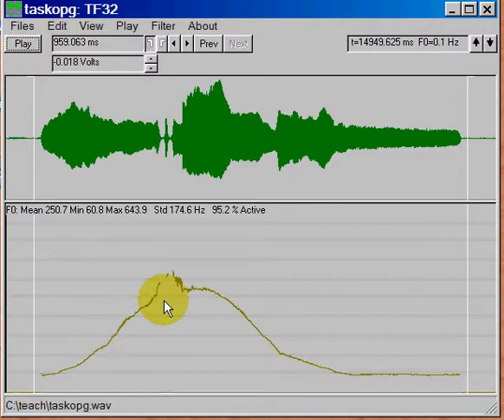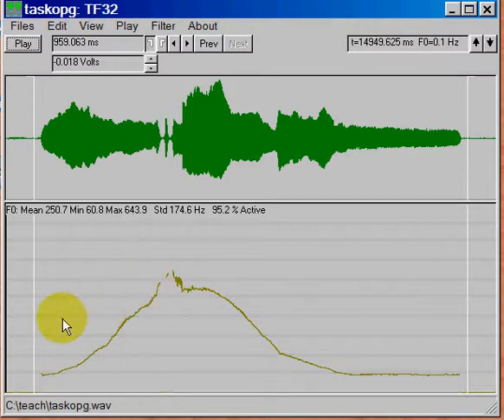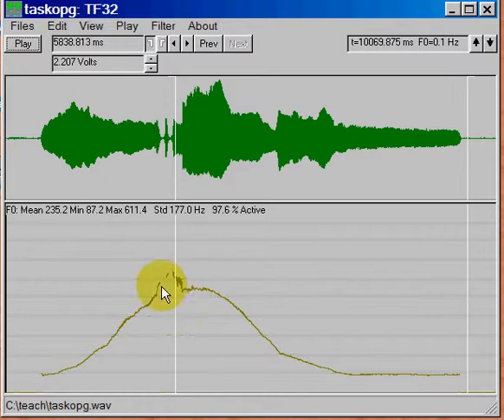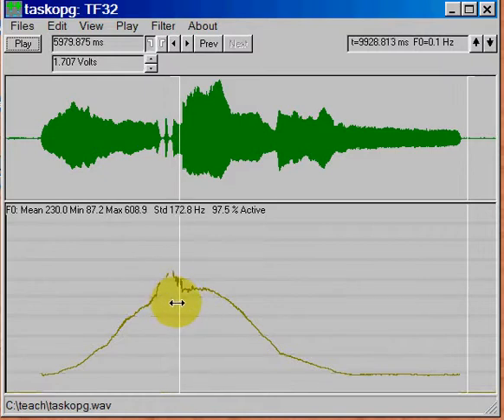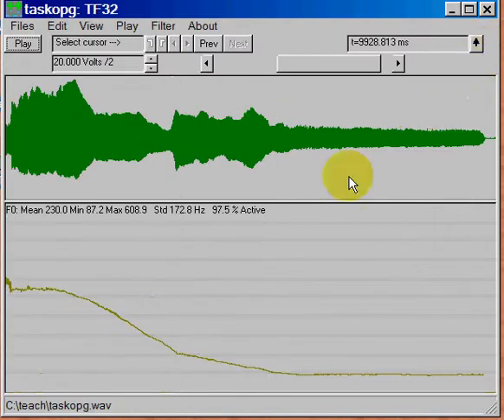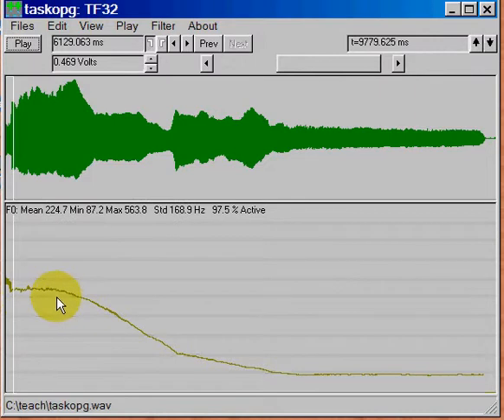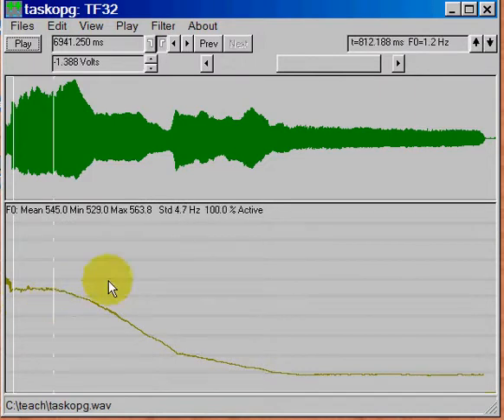And what we're looking for is the highest sustained fundamental frequency and the lowest sustained fundamental frequency. So what we can do is just kind of come in on this. I'm going to ignore this little area here because clearly my voice is breaking there. And go across to here. And what I do is I find that highest point here.